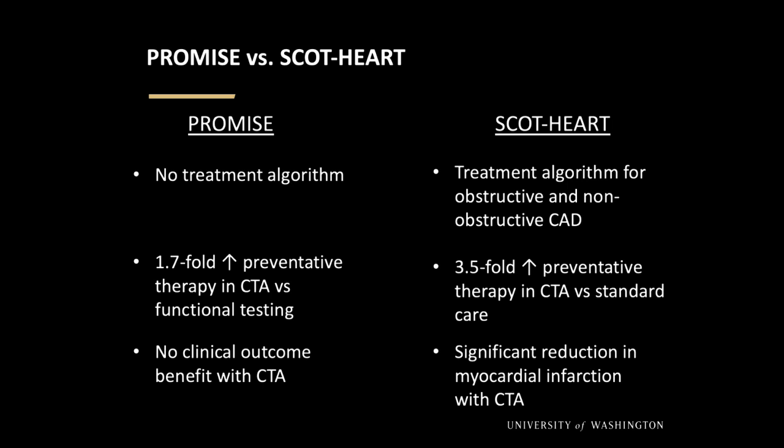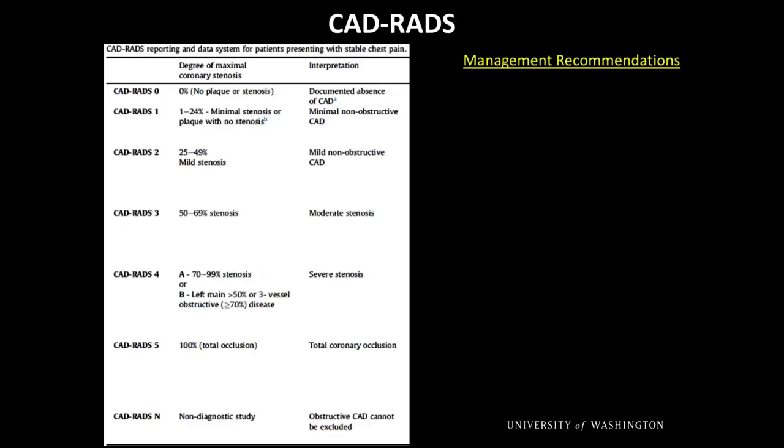I think it's important to note that they're just a different trial design, and they're really asking a different question. SCOT-HEART was adding CTA on top of standard of care and comparing it to standard of care, and PROMISE was really just comparing CTA directly to functional testing. So given the success of SCOT-HEART in finding more non-obstructive disease and treating it and better outcomes, there's really been a renewed emphasis on how we report CTAs.